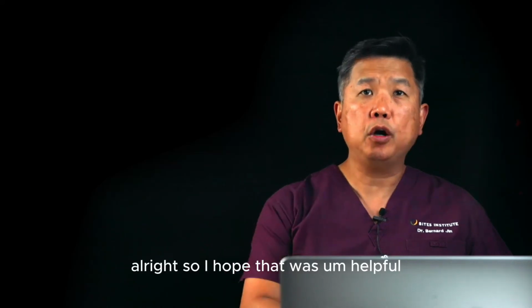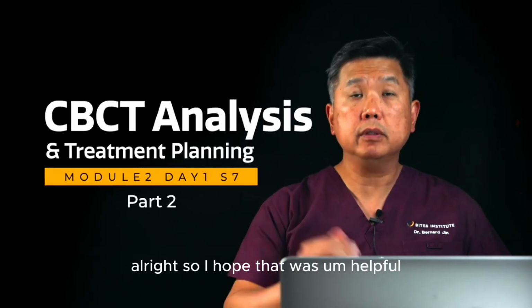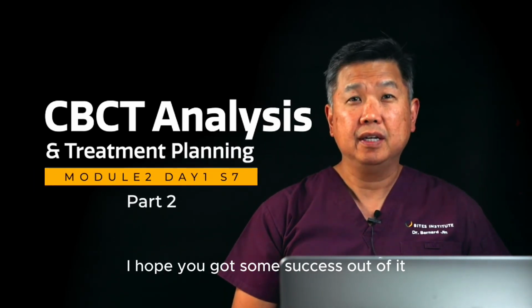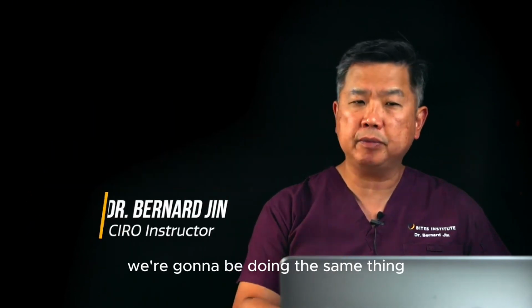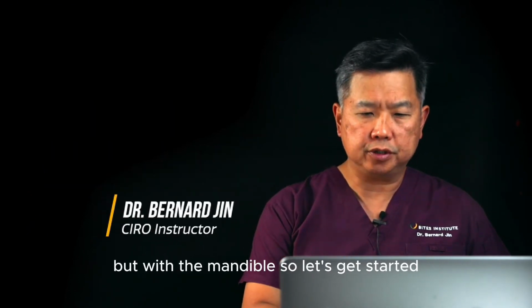All right. So I hope that was helpful. I hope you got some success out of it. Now we're going to proceed to a slightly different area. We're going to be doing the same thing, but with the mandible. So let's get started.